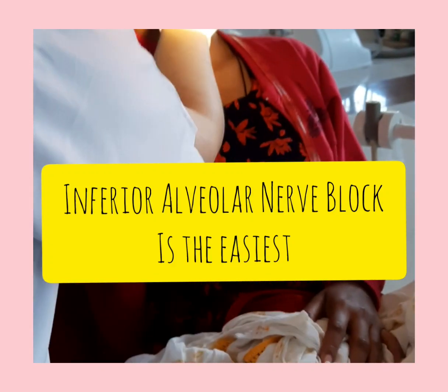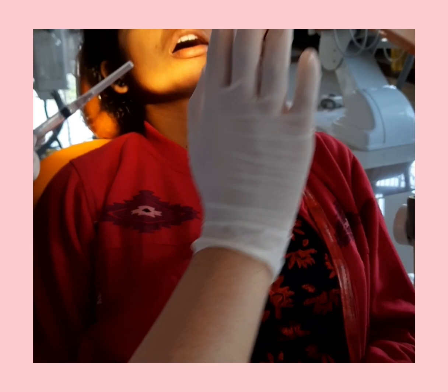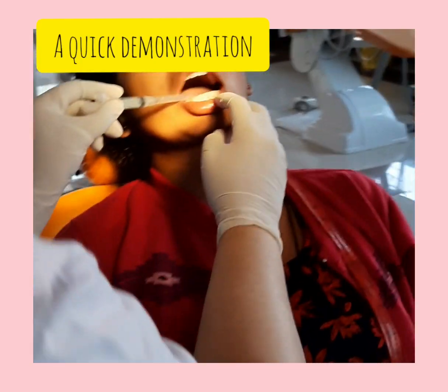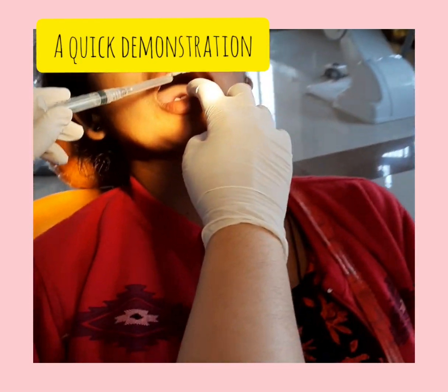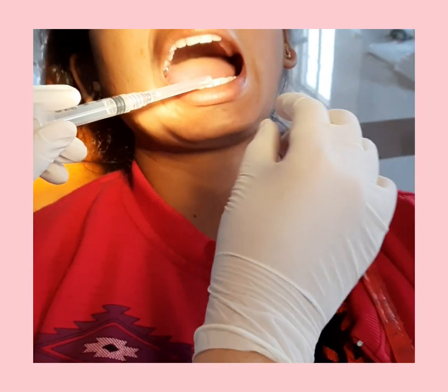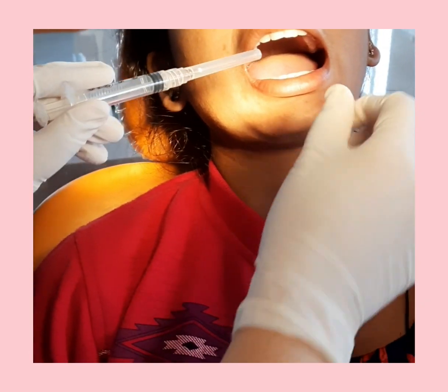Hello everyone, Fatima here. Today I'm going to demonstrate the inferior alveolar nerve block. This is the most common nerve block that we give in dentistry. I'm skipping the theoretical part, so this is just a quick demonstration.